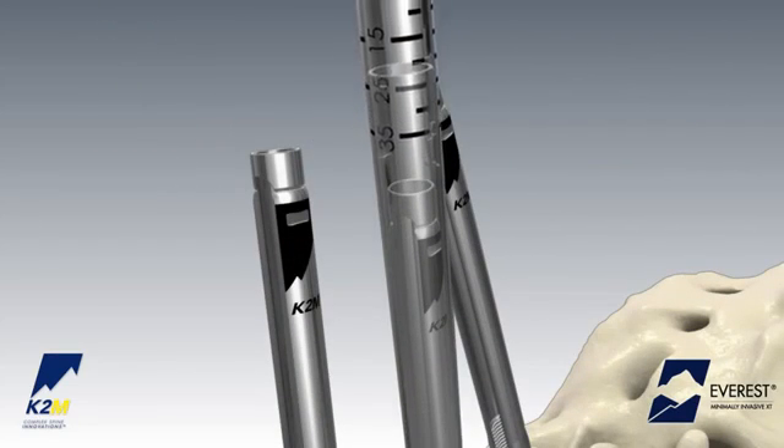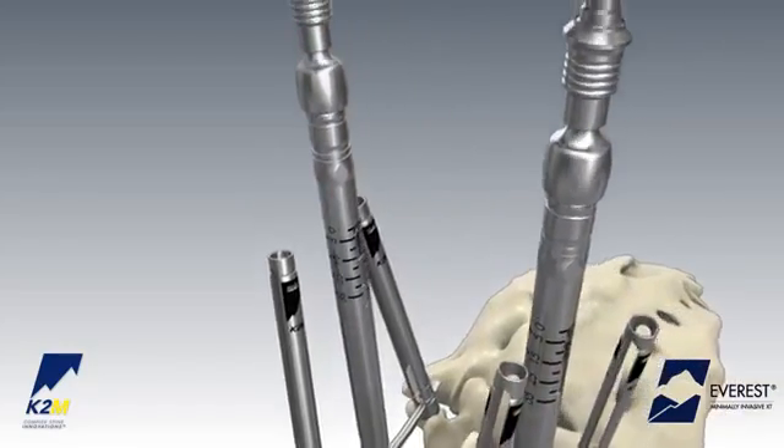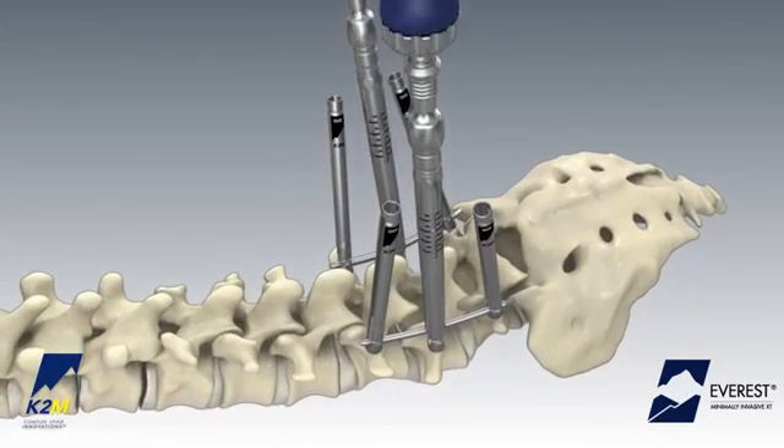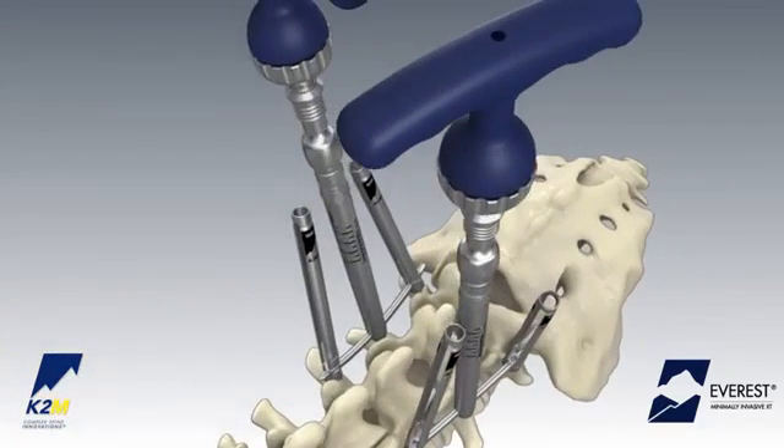Slide the instrument down towards the screw head until it engages with the reduction slots on the exterior of the extension tabs. Once engaged, rotate the proximal knob clockwise to begin reduction. External markings on the tab reduction tunnel provide a reference for needed depth until the rod is fully reduced.